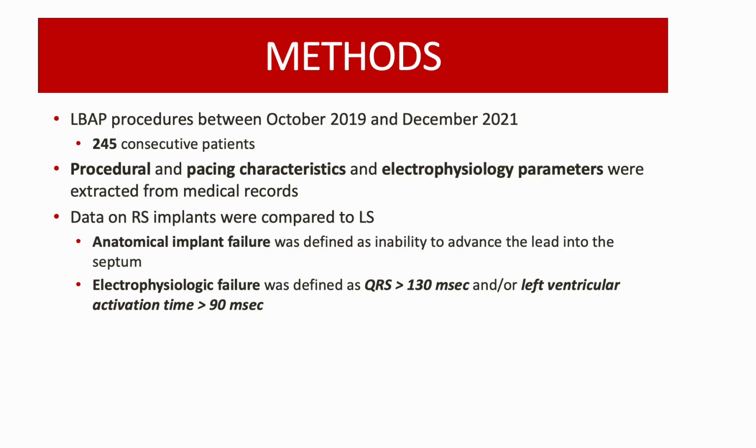During the study, 245 consecutive patients underwent left bundle area pacing procedures between October 2019 and December 2021. Procedural and pacing characteristics and electrophysiology parameters were extracted from medical records. This data was compared between the right-sided and left-sided access.